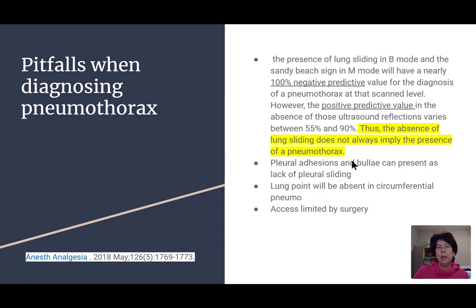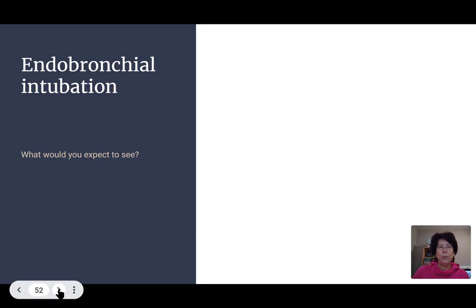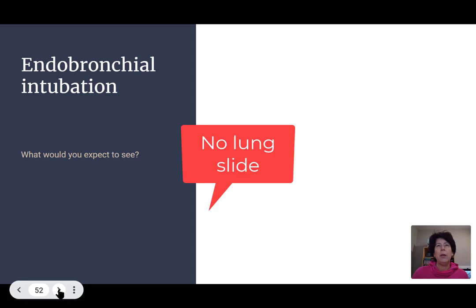So it can be a little bit difficult, but it can point you in the right direction. Now, endobronchial intubation, how would we distinguish that from the pneumothorax? What would you see? So the only thing that would be absent would be slide, right? The other things would still be there.